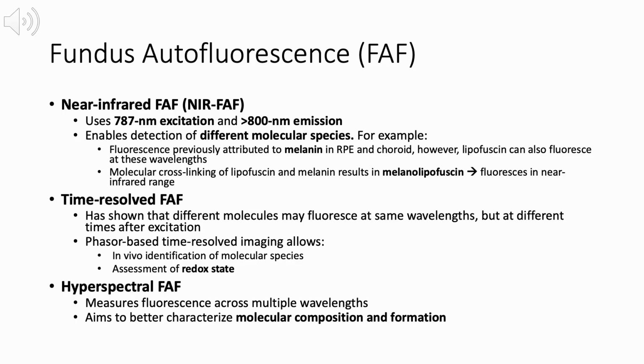Time-resolved FAF further refines molecular characterization by demonstrating that different molecules may fluoresce at the same wavelengths but at different times following excitation. Phasor-based time-resolved imaging allows in vivo identification of specific molecular species and provides information about cellular redox state, adding a functional dimension to FAF imaging. Hyperspectral FAF represents another evolving approach, measuring fluorescence across multiple wavelengths simultaneously. This technique aims to more precisely characterize molecular composition and fluorophore formation, with the goal of improving understanding of retinal disease mechanisms and progression.